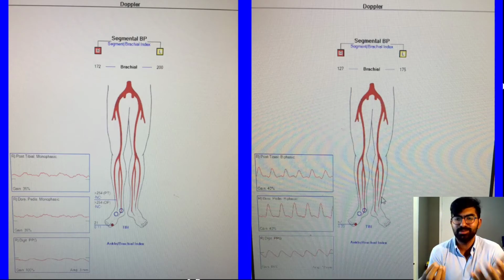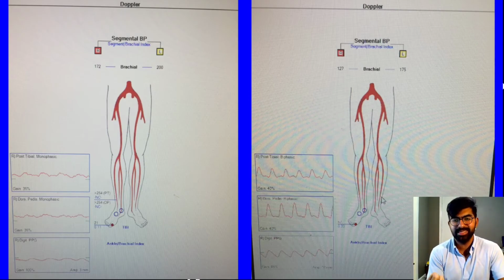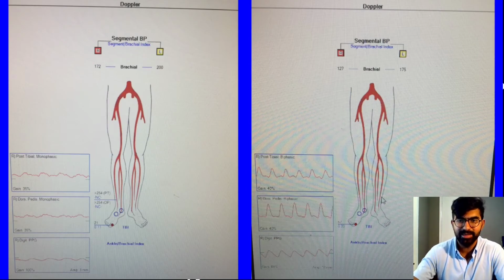Which is what's so beautiful about vascular surgery, because you know that after revascularization for critical limb ischemia, these patients get a lot of edema, and especially if they keep their legs in a dependent position, you're going to have to offer them compression stockings, wrapping, or elevation. But this is beautiful, and it all makes sense, and these waveforms show that concept.